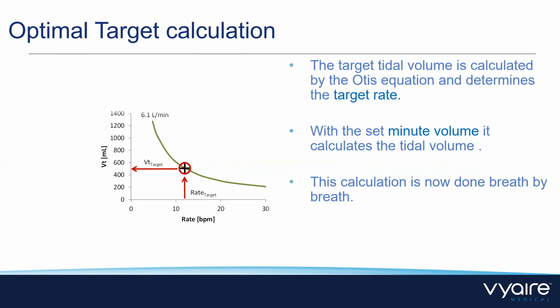And this is now done breath by breath, 24 hours a day, 7 days a week. So it doesn't get tired. It's just calculating constantly. And if the patient is improving, if the patient is worsening, if the patient is turned to the side, if the patient is turned back to supine, it constantly calculates and recalculates for the optimum target, and consecutively also for the optimum tidal volume, always in relation to the minute volume set.